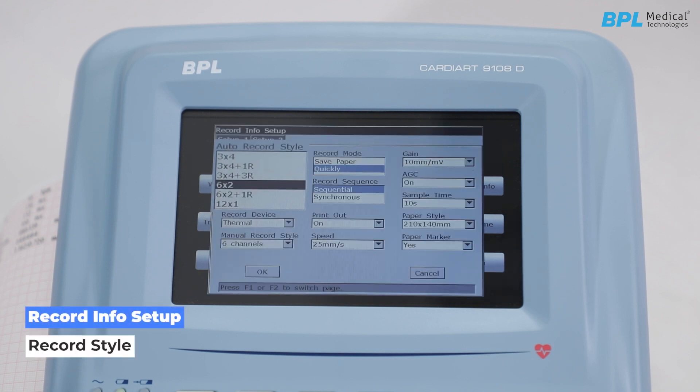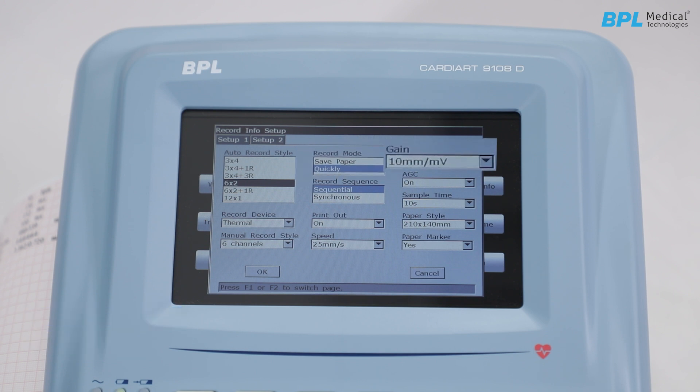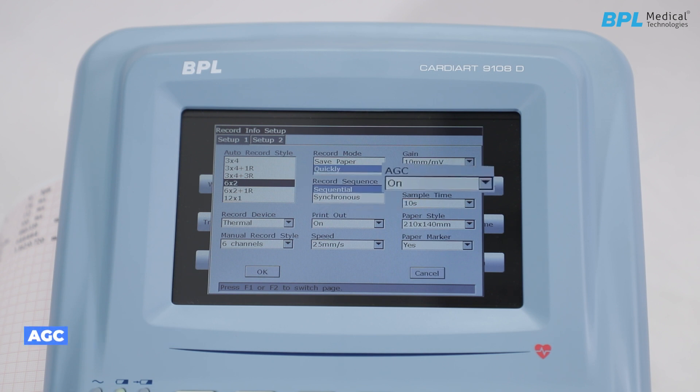In record info setup, record style sets the print format for the printout. Record mode includes Save Paper, which prints after a 10-second sampling on a single paper, and Quick mode, which prints immediately in a detailed layout. Gain is 10 mm/mV by default. Record sequence allows leads to be printed sequentially or synchronously. AGC (auto gain control) automatically adjusts gain according to actual signals. Record device is set to thermal printer by default; an external printer can also be selected. If printout is off, the ECG report will be saved without printing.